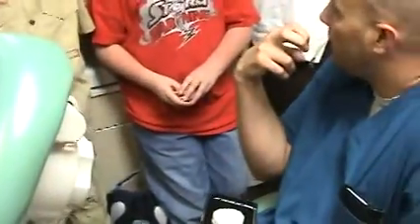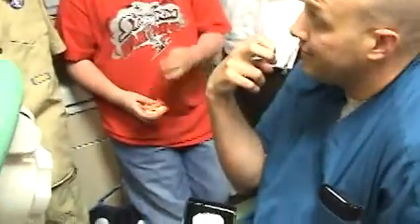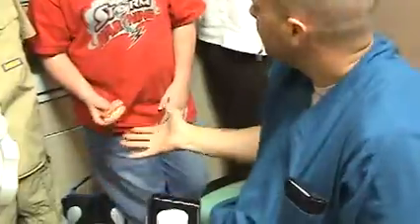Could you pull it off? You can pull the denture off, but the implants are embedded in the bone. It's going to heal. They're not coming out. Broke it. Took it apart.